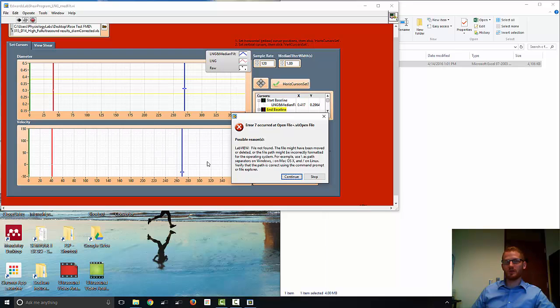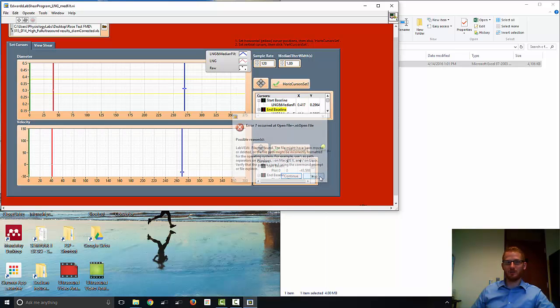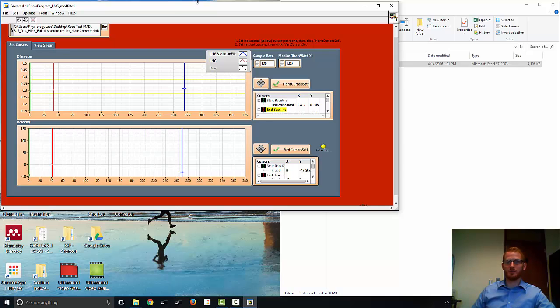So when you open this, because it's looking for a file from another computer that doesn't exist on this computer, it's likely going to pop up with this error. That's okay, just tell it to stop. And basically that makes it so it'll be ready for you to load a new file.